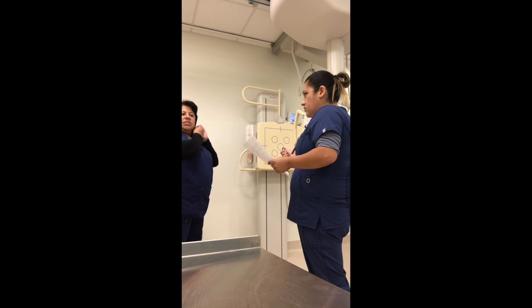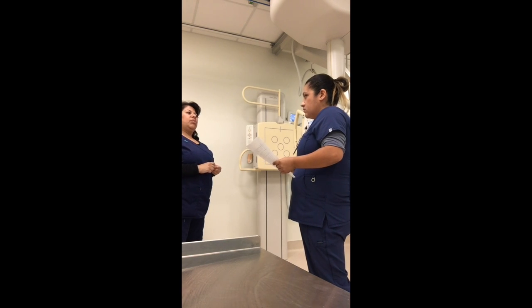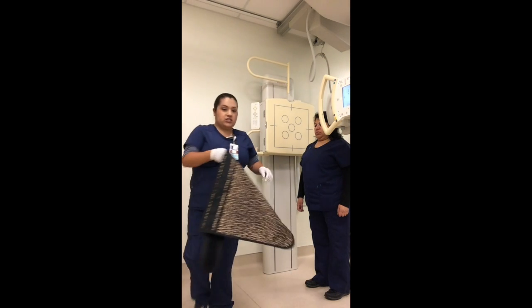Okay. And what brings you in today? Well, just having some headaches, so they just want to check if there's something, and I had a car accident, so just want to make sure everything is clear. Okay. I'm starting with my lateral, so before I begin, I'm going to shield my patient.